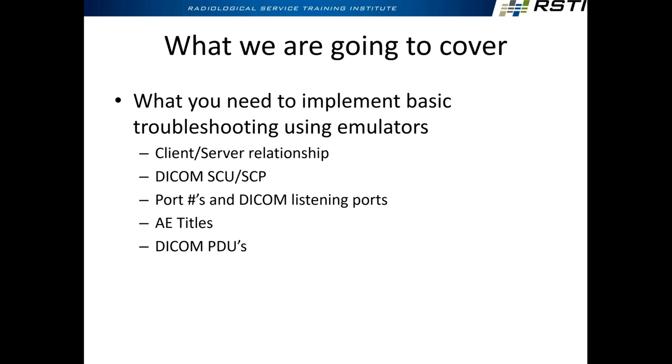What do we need to implement basic troubleshooting emulators? We need to understand what's called the client-server relationship. Many of you may have heard that before when it comes to computers, internet technology, client-server. In DICOM terms, we call that SCU and SCP, service class user and service class provider. I'll talk about what the SCU and the SCP mean and how they relate to the client-server relationship and why that's important when we're trying to troubleshoot.